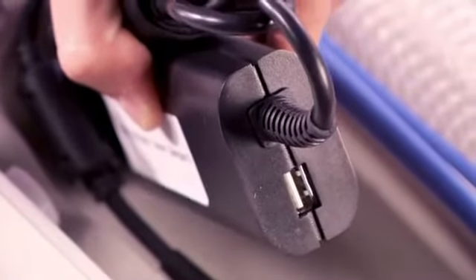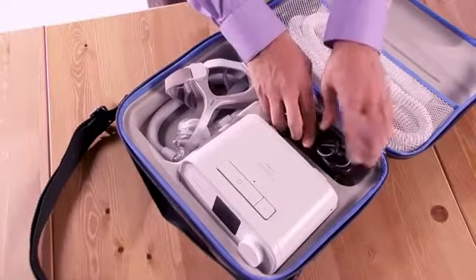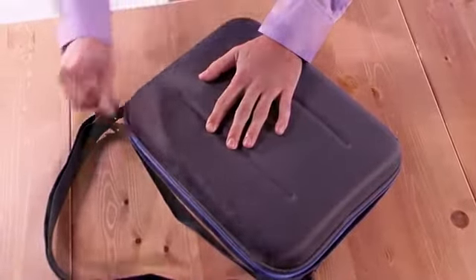The kit comes with a 65-watt power supply that has a USB port to charge those additional electronic items you take when traveling, like your cell phone or tablet. Note that this power supply will not support the optional humidifier.